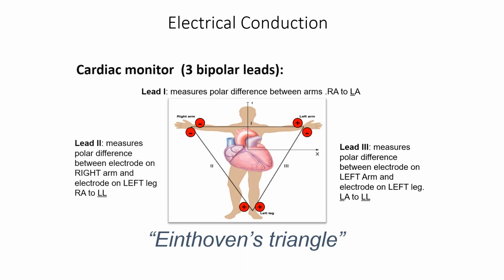Another thing to note is that lead 2, since it does go across the chest, it measures respiration rate based on impedance changes in the chest. As the chest rises and falls, the impedance changes. So we get different impedance equals respiratory rate.